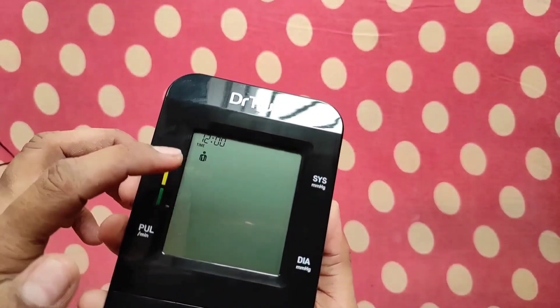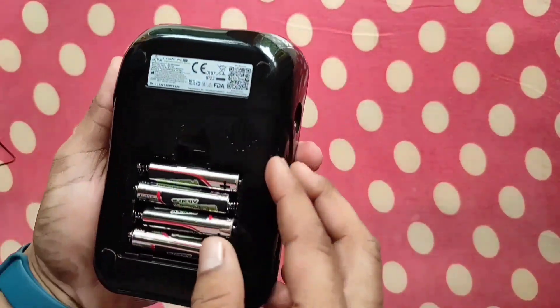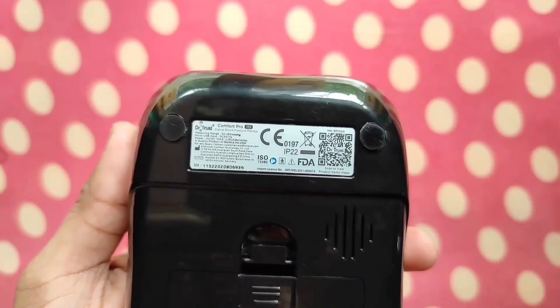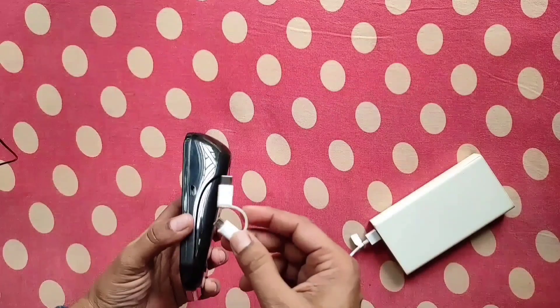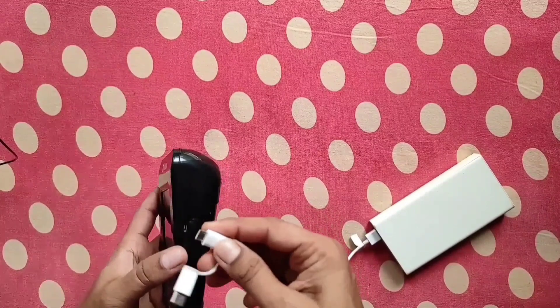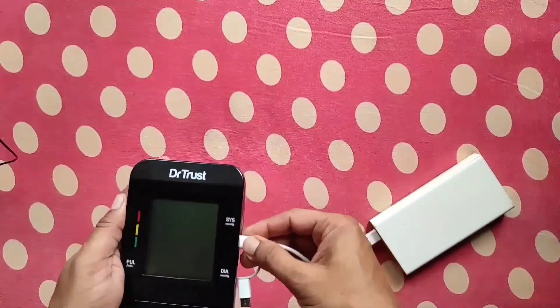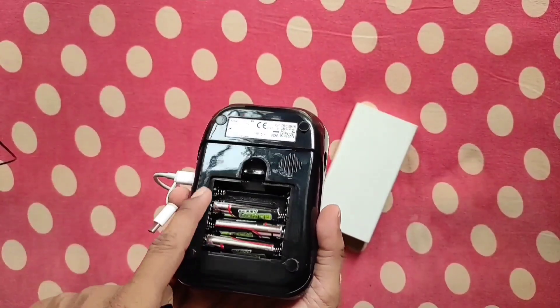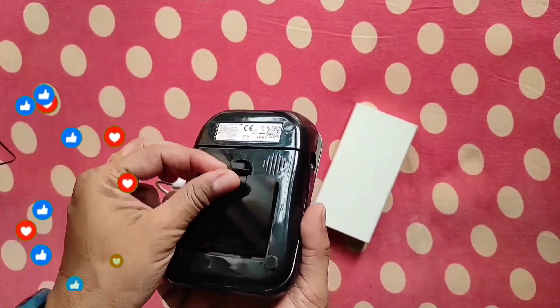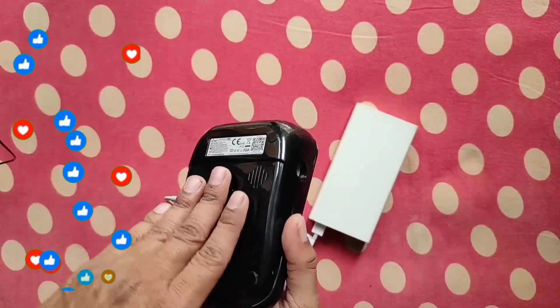Now you can see the display coming on the screen — here you can see the product serial number, which confirms it is genuine, and it is also written here: FDA approved. We are now operating the BP monitor via a power bank, and it is working normally. I have disconnected the batteries from the battery compartment, so it is working only on the power bank.